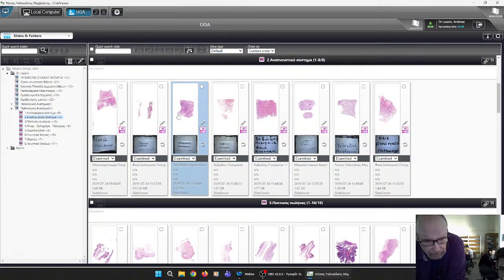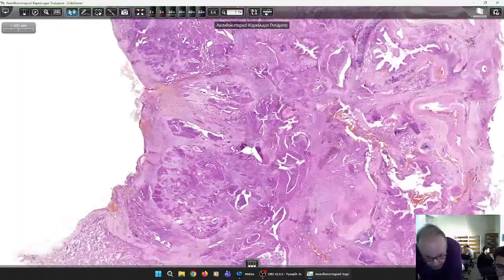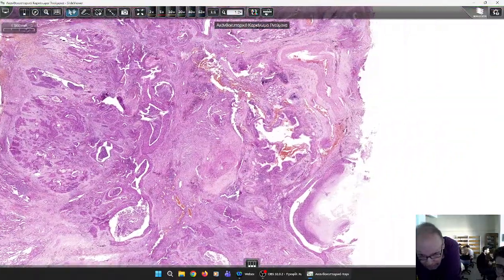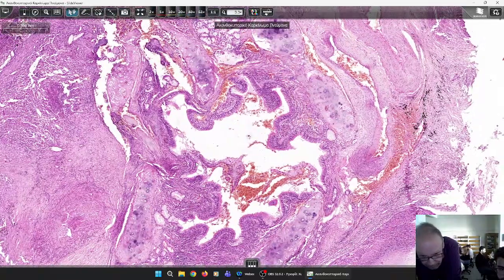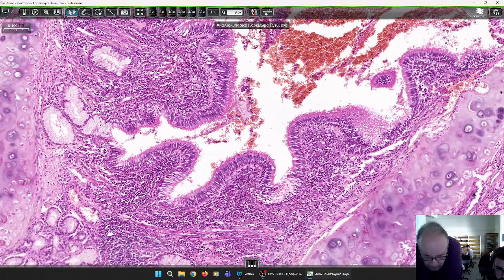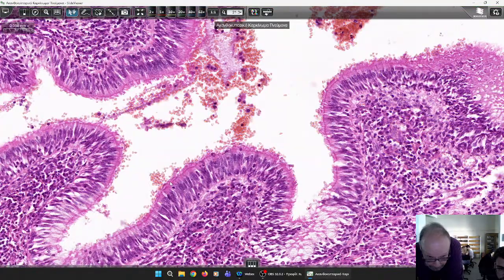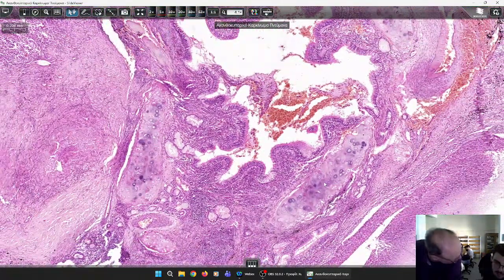This is the slide. Have a look at the slide, squamous cell carcinoma, so that you open it. Now, as previously mentioned, squamous cell carcinoma has a central location. This is evident here because what is this structure? Have a look at the epithelium lining it with all these cilia. Look at the cilia and the pseudostratified epithelium. This is a bronchus, okay?